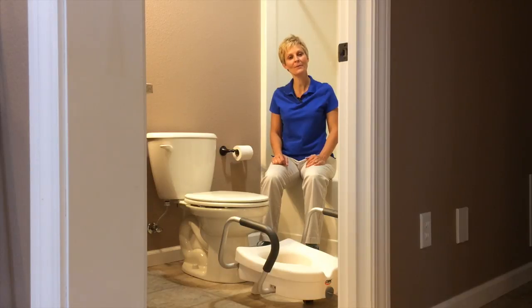Hi, Cindy here, Physical Therapist with Adaptive Equipment Corner. Today we're going to show you how to put a raised toilet seat on a toilet.